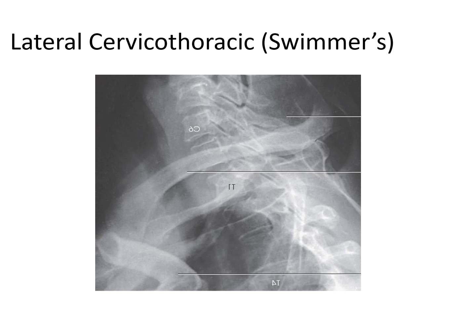Okay. Now, what do you need for successful swimmers? You need to see disc spaces if possible without superimposition, but more importantly, you need to see anterior alignment of the vertebral bodies. If the anterior alignment is not there, then most common cause is herniated disc.